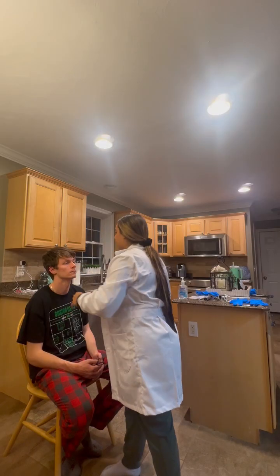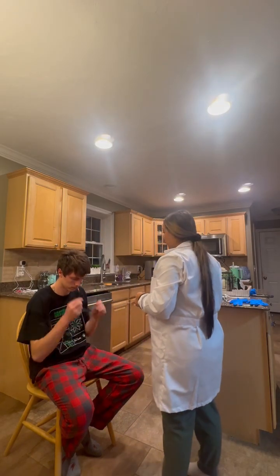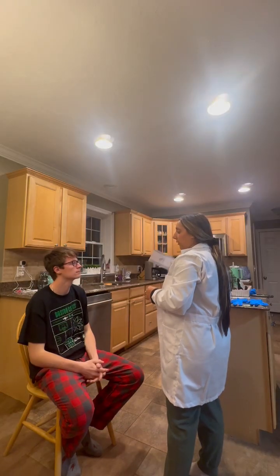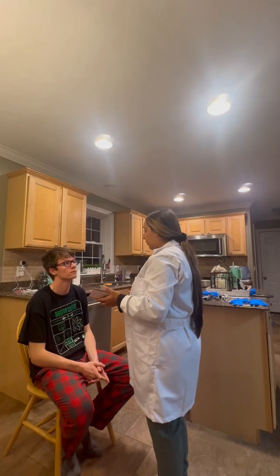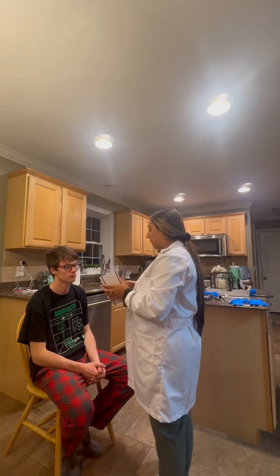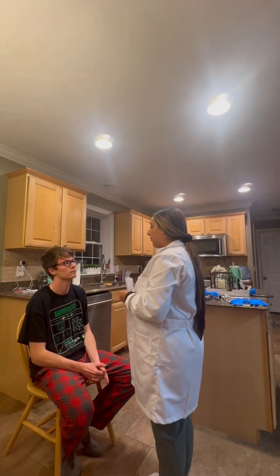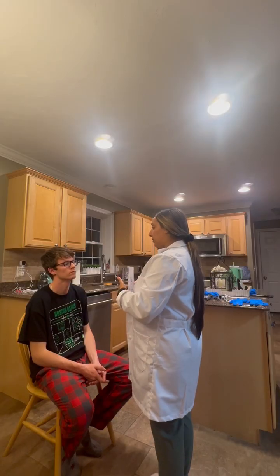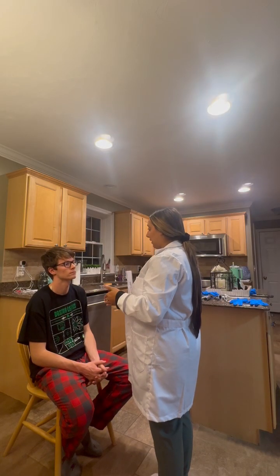All right. Okay. I'll have you put your glasses back on because we're gonna be getting into a visual acuity test, the Snellen eye chart. The Snellen eye chart is used to test for visual acuity, especially when people have glasses. They should wear them just to make sure that their lenses are corrective for this test. For this specific form, we'll be doing 6 feet. I will have you cover one eye, read the lowest letters that you can read, and then I'll have you repeat it with the other eye.